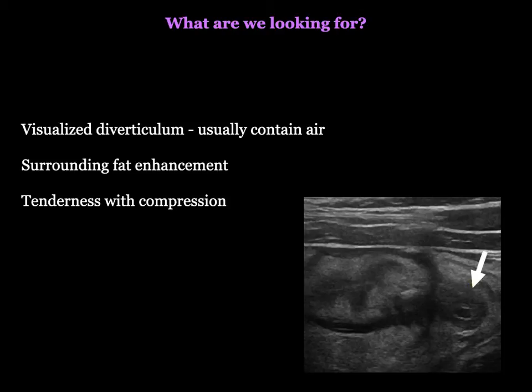So as you're looking through that area of bowel, you may find multiple other diverticula that likely don't have any fat enhancement and are not tender with compression. So you're looking for the one that does have fat enhancement and is tender when you compress with your ultrasound probe.